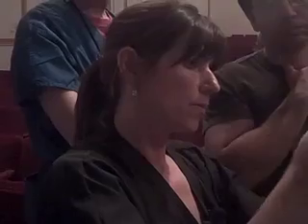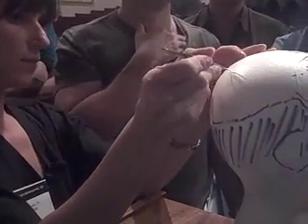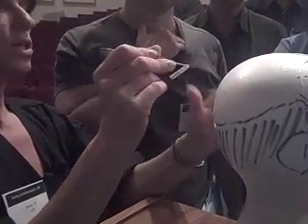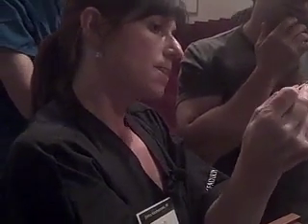So the same thing here, parallel to the graft, and I'm inserting in a temple, and the same thing would happen on a lower vertex. And when I'm working in a vertex, I will position myself in such a way that I can turn, and then turn it from this place, and I'm going to turn it more around. So awareness of the curl, and if you have angled forceps, the tip that goes in is what has to be parallel with the direction of your site.